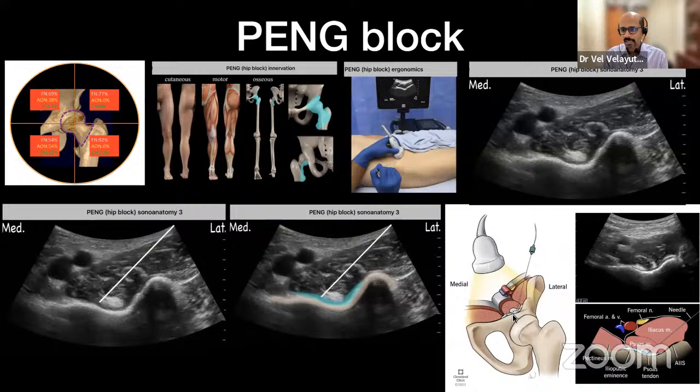So what's more important, you have to be mindful of the femoral nerve, femoral vein, and femoral artery. Those are the structures that are here. In this picture, they're here, femoral artery, femoral vein, and femoral nerve. You're fairly lateral to it, but just be mindful in case you're coming fairly this way, don't hit the femoral nerve, especially if it's a patient who's doing it under general anesthetic.